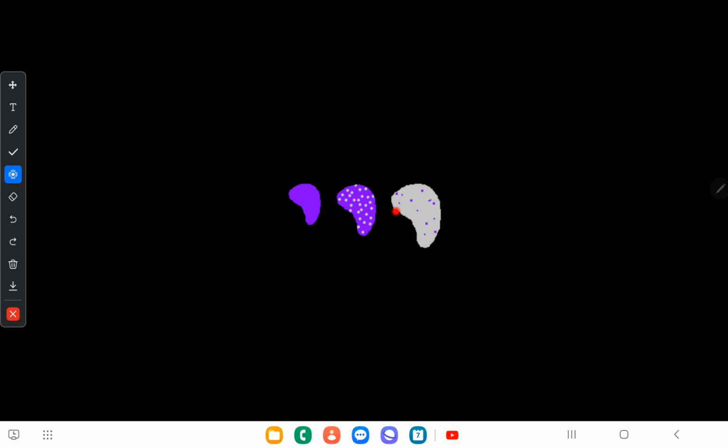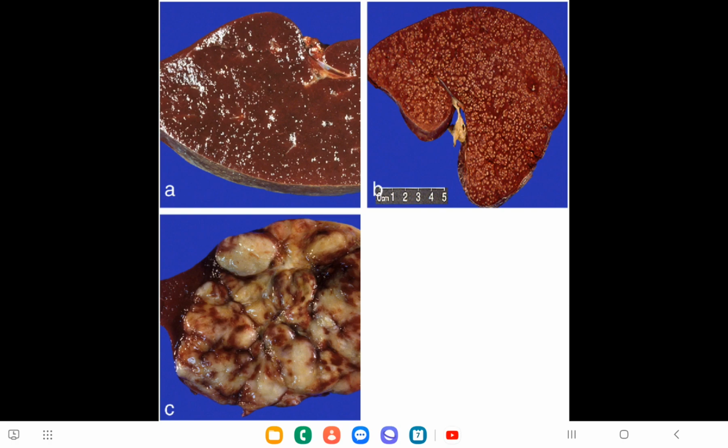Here you can see only a small amount of purple dots, which means a small amount of intact spleen. The whole whitish material is amyloid protein. Therefore, there is more diffuse involvement in the lardaceous spleen. Here you can see the macroscopic appearance of a spleen with amyloid deposition.